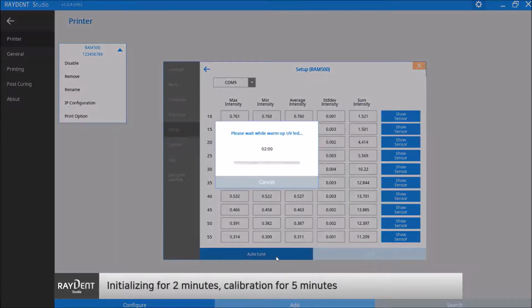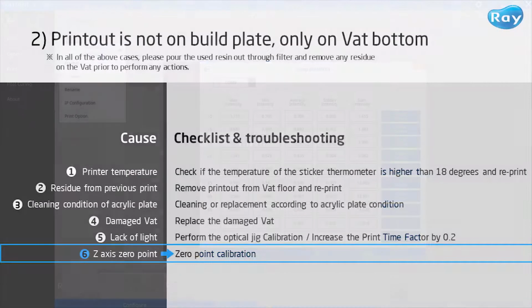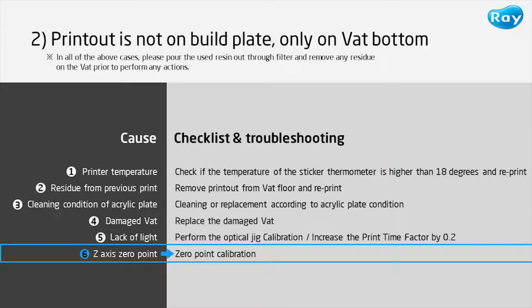And the light jig will collect the printer's light intensity information after warming up for 2 minutes. Once the process is done, click Save and the mask map light calibration is completed. The sixth possible cause is the 0 point on the Z-axis.